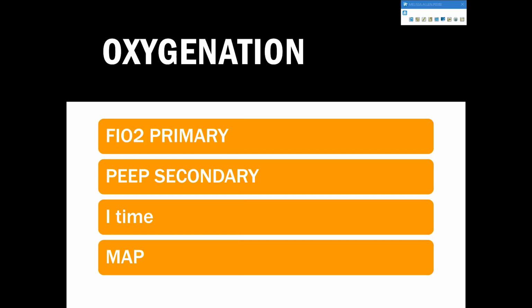Mean airway pressure here, it's not a setting on any of our current ICU ventilators. However, mean airway pressure is oxygenation. So if you have these patients with higher mean airway pressure, that is helping you. So sometimes it's very odd to think about it, but the rate will even help your oxygenation. Sometimes you're like, well, my PaO2 went up a lot when I went up by 5 on my rate.